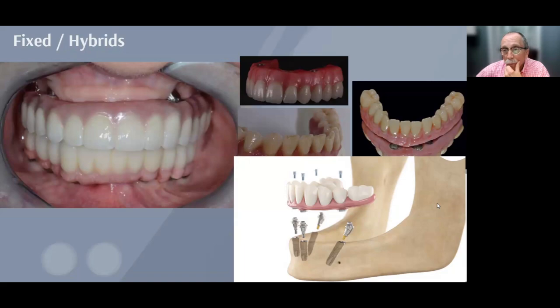There's some that I've had good success with and others that have been a challenge. I mean, the challenge for the dentist is getting this stuff screwed in the back. So ones that have easier, better delivery systems, we've seen some of these angled abutments break because if you think about it, that abutment in the posterior has to be able to receive that screw that holds it in and then receive the screw that holds the appliance on. So you have to build the abutment around those screw channels. And so that makes them either not solid, half hollow, or whatever you want to call it. And so we've seen some fracture of those abutments because they're not robust enough.